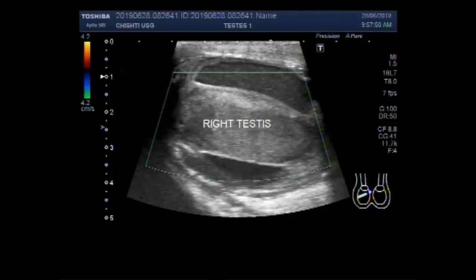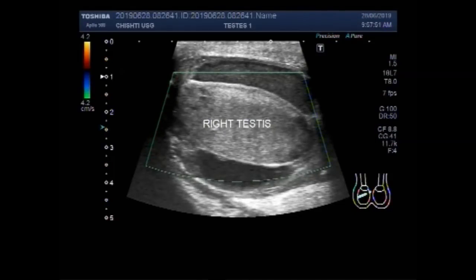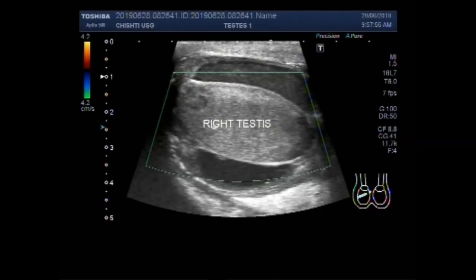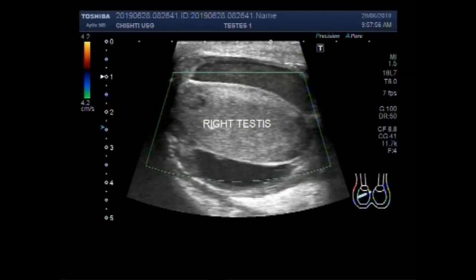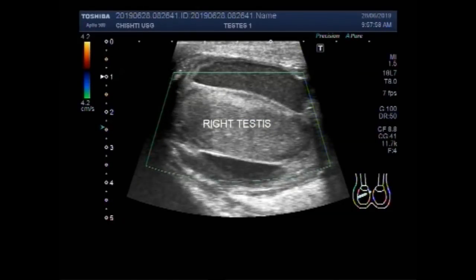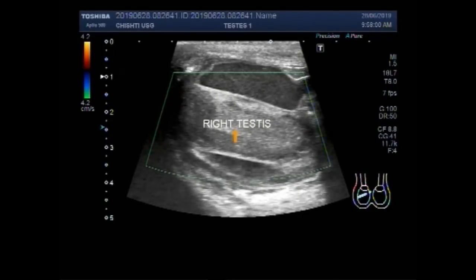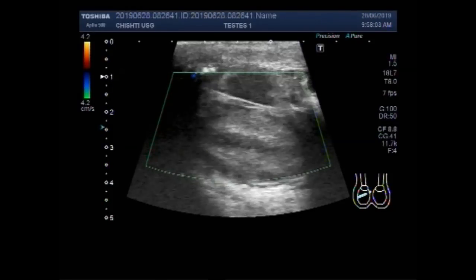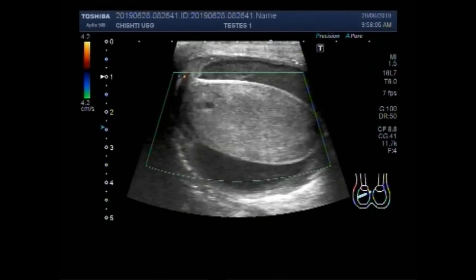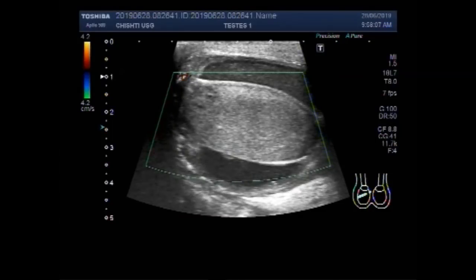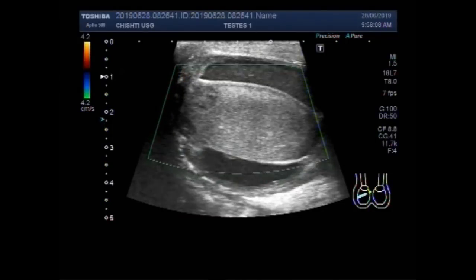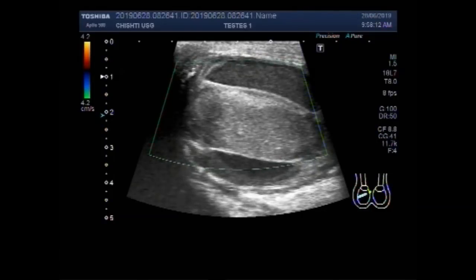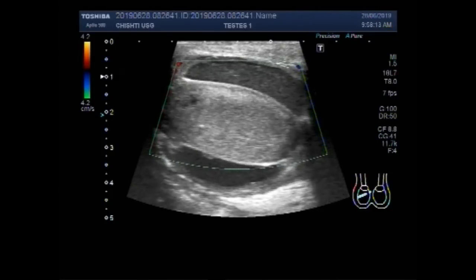However, there is a small mass visible in the medial side of the right testes, and this testes has a large pyocele encircling it.